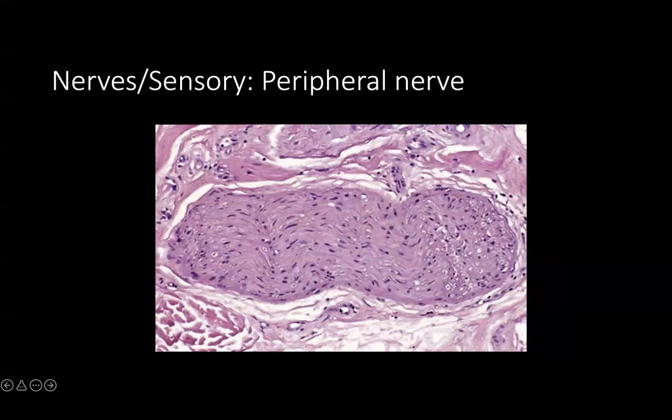And then you would want to measure that, because if you have a nerve that's greater than 0.1 millimeters in thickness and it's involved by a neoplasm, that becomes important in a prognostic sense. A lot of the surgeons are going to want to know that as well, just to understand how aggressive this tumor is. So definitely look for normal nerves and also perineural invasion.